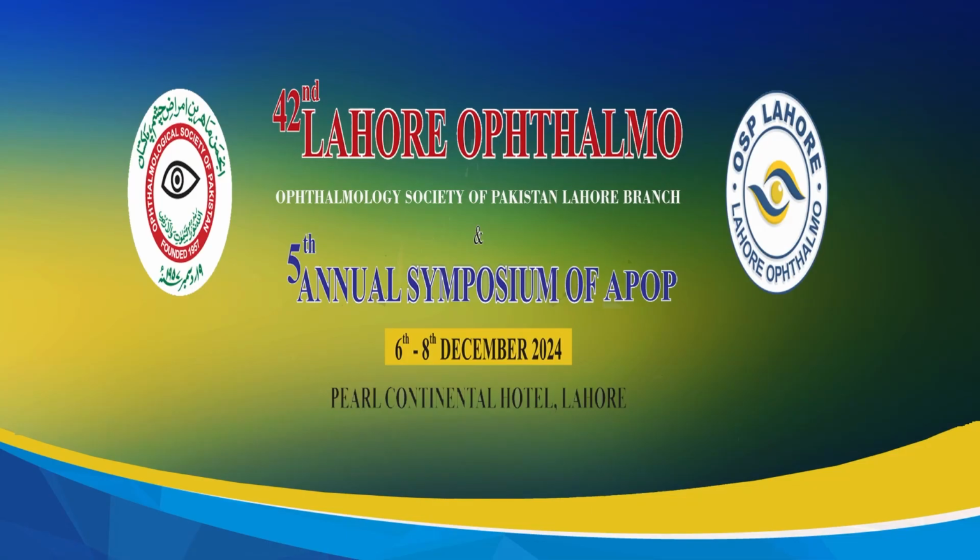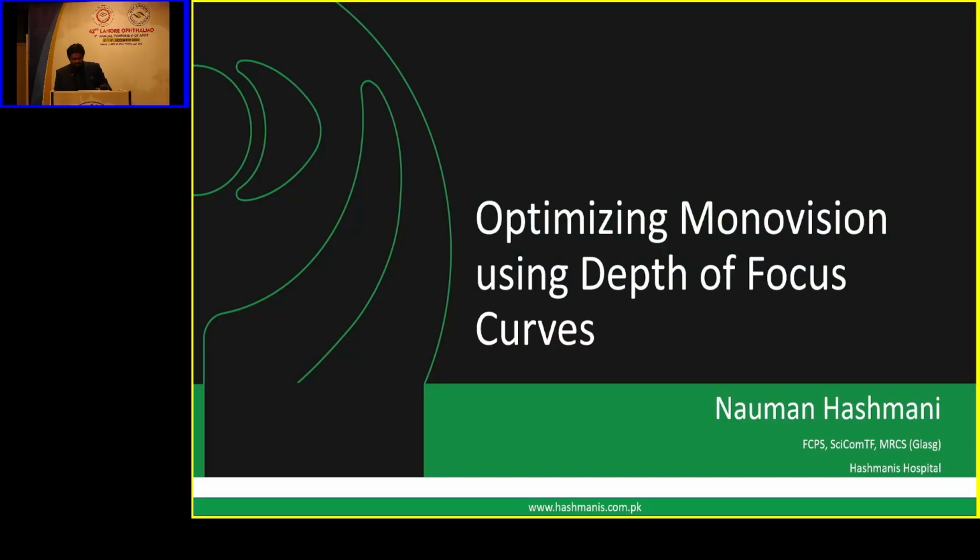The next speaker is Dr. Noman Hashmani. So my presentation is on optimizing monovision surgery. Monovision surgery, for those that don't know what it is, is a technique of doing cataract surgery where you induce myopia in the non-dominant eye and have the dominant eye being emmetropic.